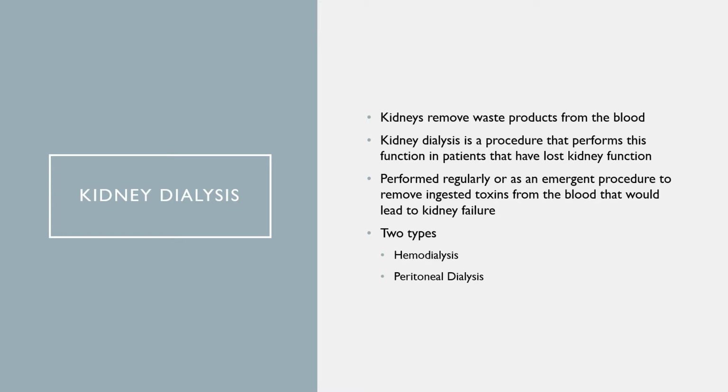All right, hemodialysis is going to include the blood being shunted into a heparinized hemodialysis machine. Blood's filtered and returned to the body. It's going to leave the body through an artery and it's returned through a vein. The process usually takes 3 hours and it's done 3 to 4 times a week. So these patients are very involved in this.